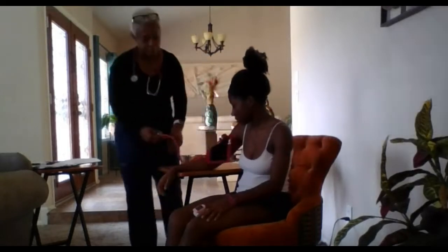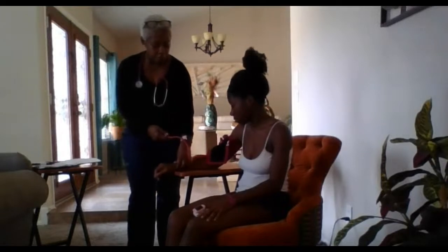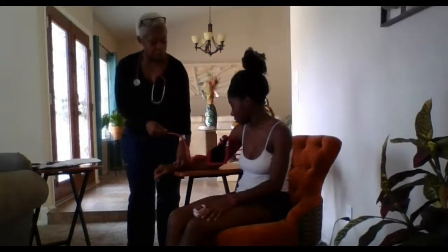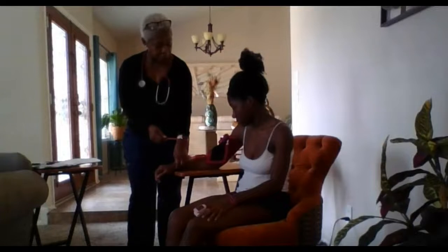And the two-step method dictates that I first check your radial pulse, and I'm going to pump it up until I no longer feel the radial pulse. Okay, looks like it's at 100. I no longer feel it. Okay.